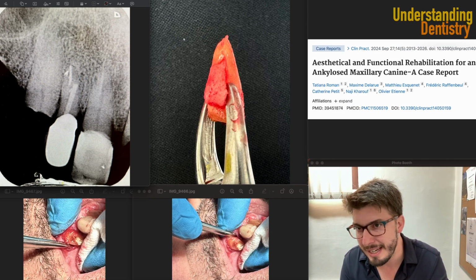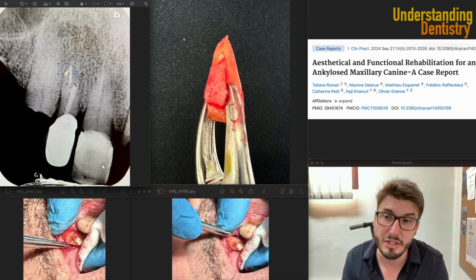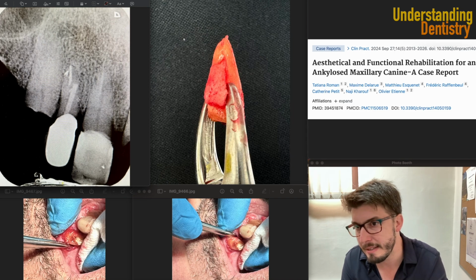Then we have the root canal treated to the apex, but now we have also this image here, which could be just some root canal materials that went through a lateral root canal of this root. But okay, so we can still see the periodontal ligament space, and that's fine.